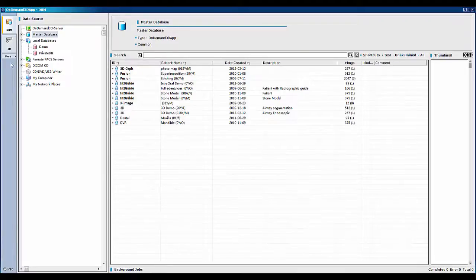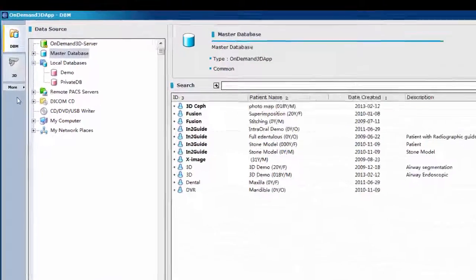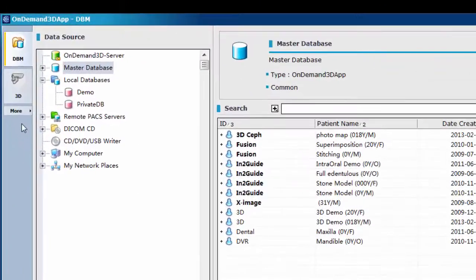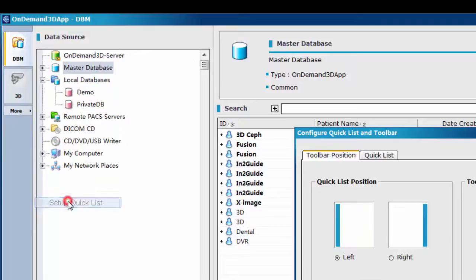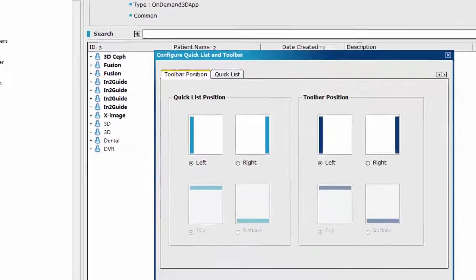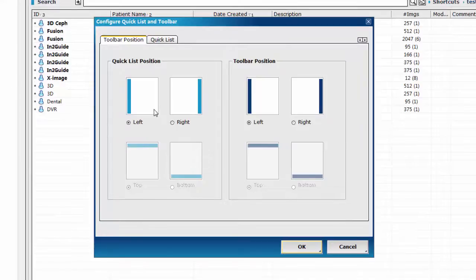Next, we will show you how to configure which modules and the number of modules to display in the quicklist. Click the more icon and select setup quicklist. Then the configure quicklist and toolbar window will pop up. In the toolbar position tab, you can choose preferred positioning for quicklist and toolbar.